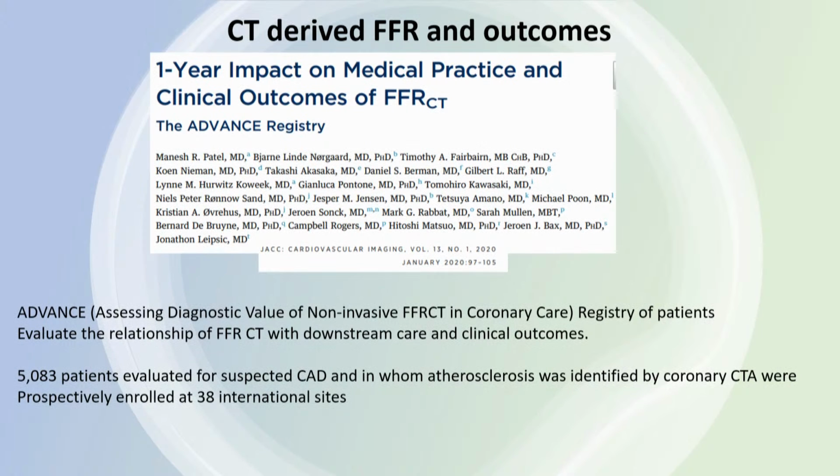So moving on, is FFR associated with adverse outcomes? This is being addressed with the ADVANCE Registry, which stands for Assessing Diagnostic Value of Non-Invasive FFRct in Coronary Care. It's an international registry of patients from, I think, 38 different sites where they're looking at the relationship of FFRct with downstream care and clinical outcomes.